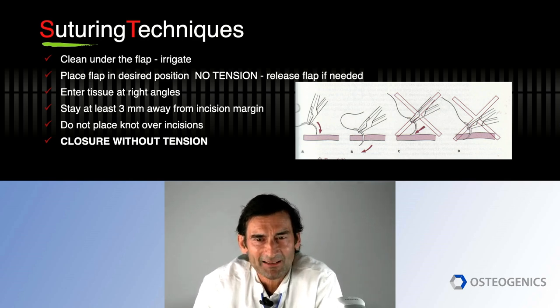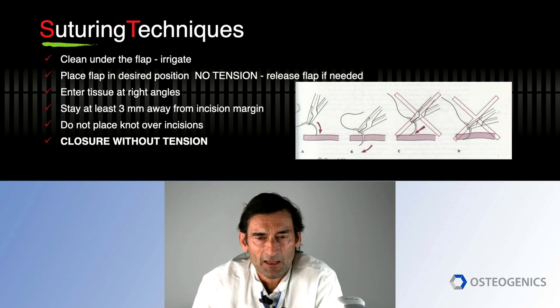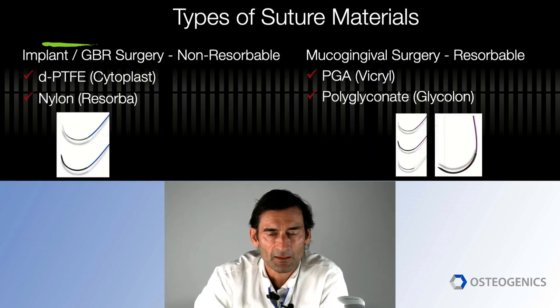Another top priority key point is to never place a knot on top of an incision, because with the thickness of the knot and possibly some bacterial content, that can move into the incision and give you an inflammation. So suturing has some basic simple principles, and again, closure with no tension.